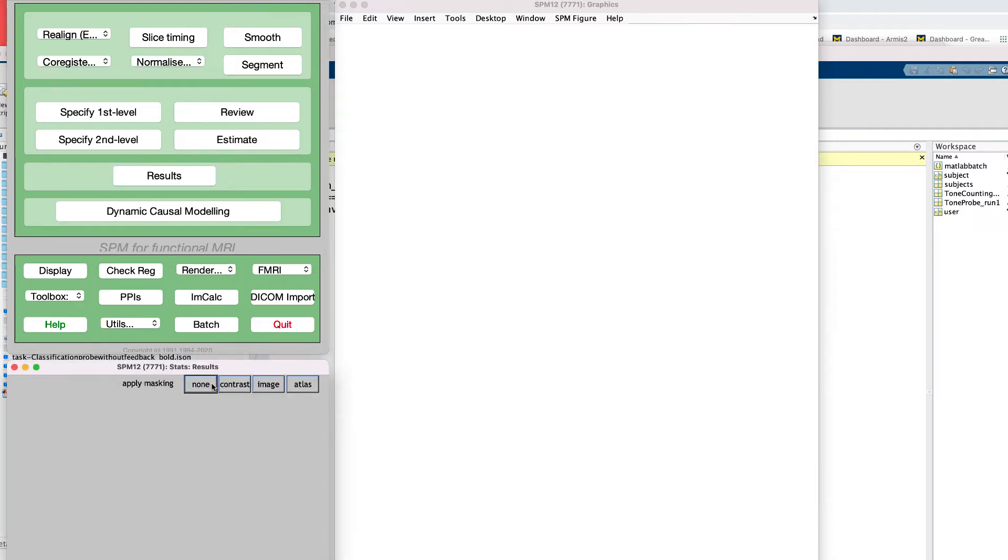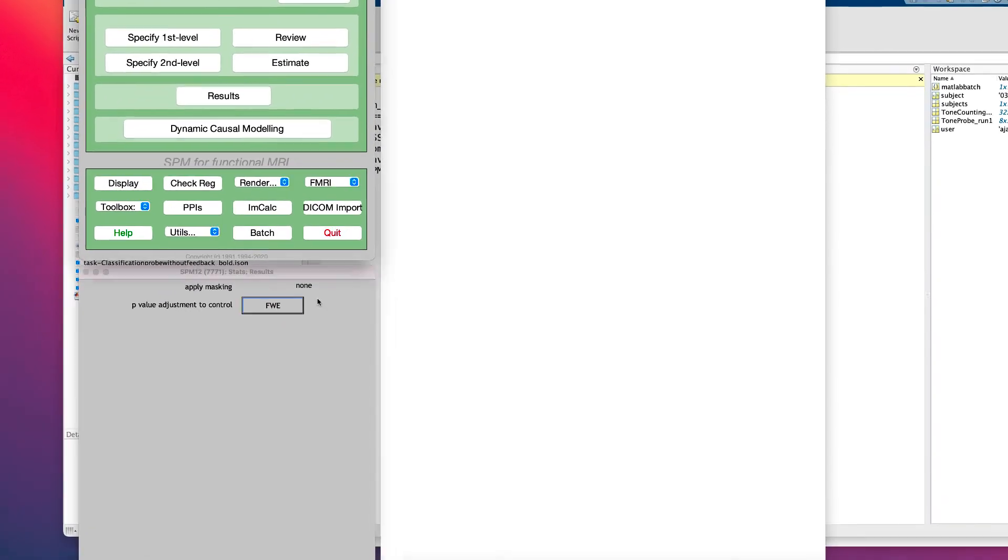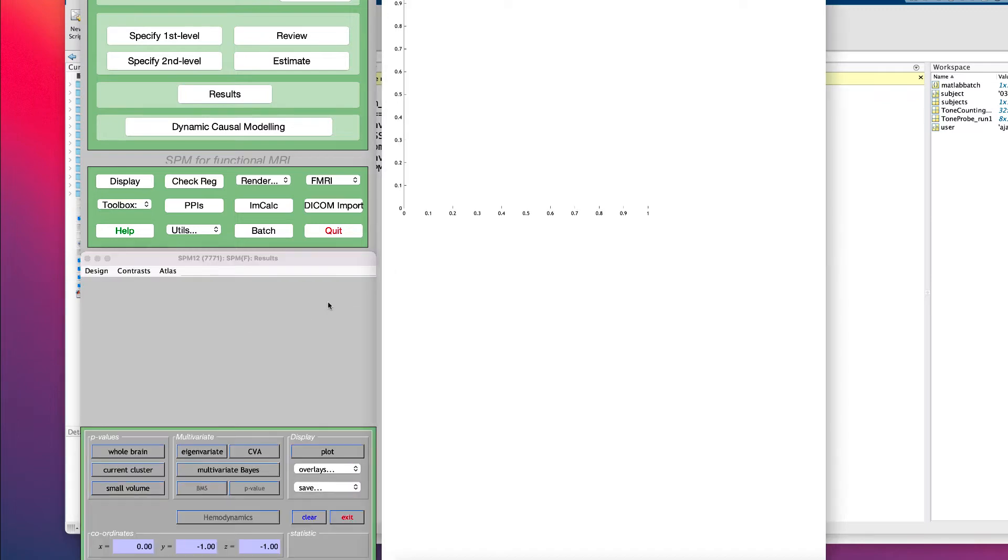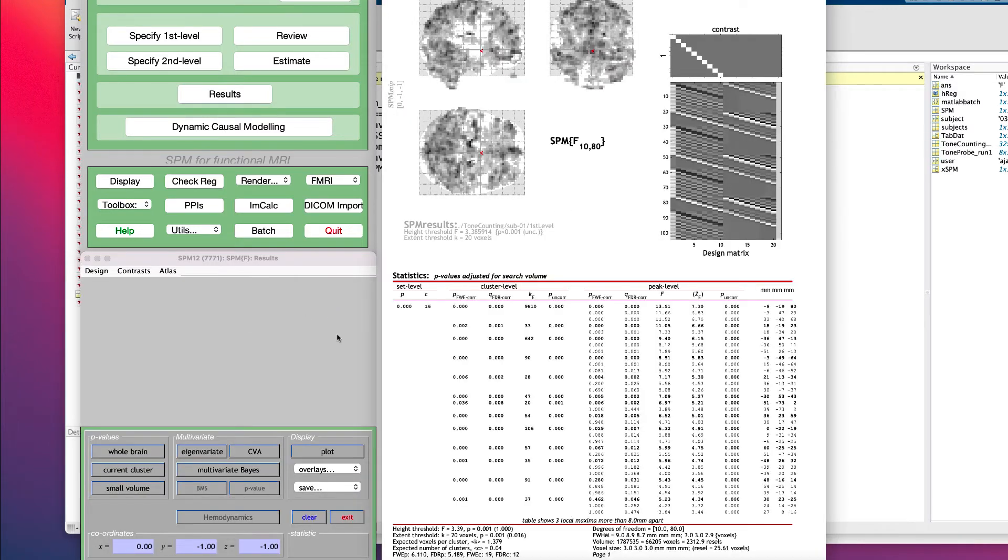Similar to the Flanker analysis, set Apply Masking to None, the p-value adjustment to 0.001, and the extent threshold to 20.